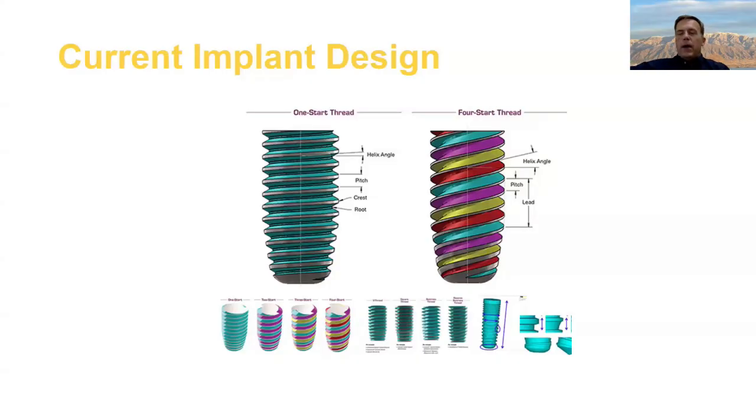Couple other things to think about: there are some implant systems that have the same size platform for a variety of different implant sizes, and that can be really handy for you prosthetically. And sometimes you can find ones that have different thread patterns for, say, immediate cases and dense bone cases and stuff like that, but the same instrumentation on the surgical side. So you can see that you can optimize the implant side of your practice by making sure you select an implant that helps you out.